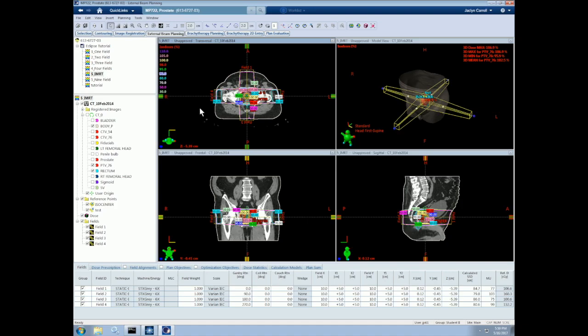Second, we need to make sure we check the beam geometry, including the gantry angles, couch angles, and collimator rotation, as the inverse optimization does not optimize the beam geometry and instead uses the initial positions provided by the planner, other than the collimator positions, which can be optimized by the system.